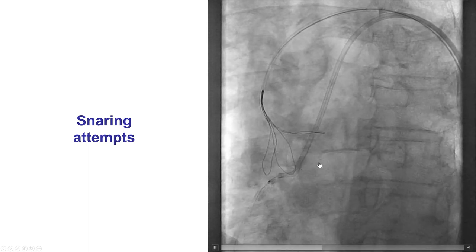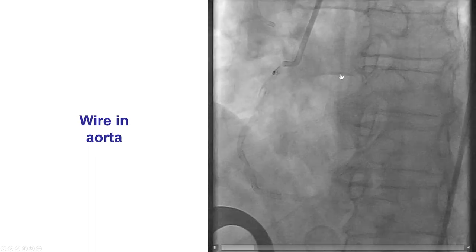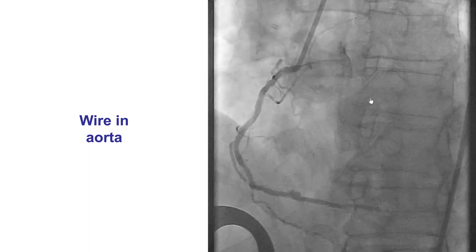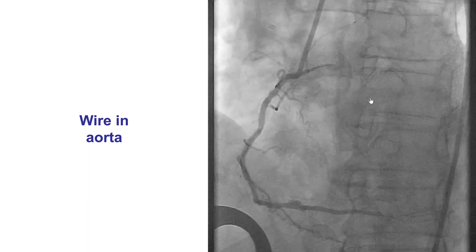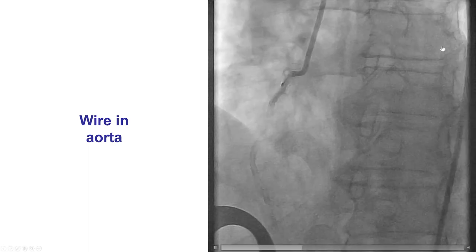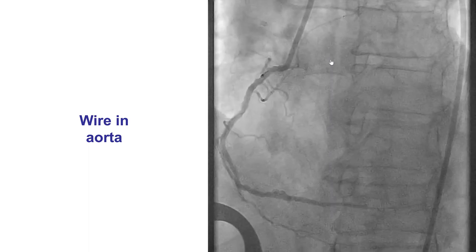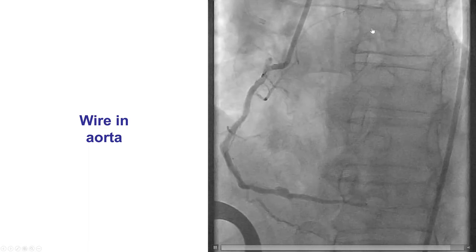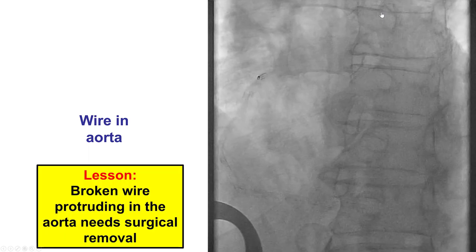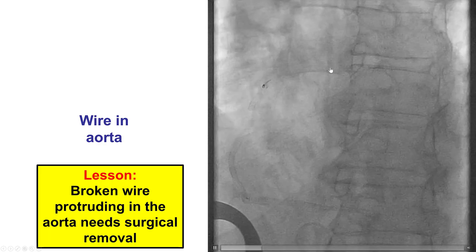This is a large ensnare trying to retrieve that part of the wire, without success. In another view, we can see intermittently the wire protruding from the proximal right coronary artery back into the aorta. What we now have is a fractured guide wire protruding into the aorta. This cannot be solved percutaneously because the coils of wire could cause thrombus and embolization either in the coronary or even worse in the systemic circulation, including stroke. When this happens, surgery is the only solution.